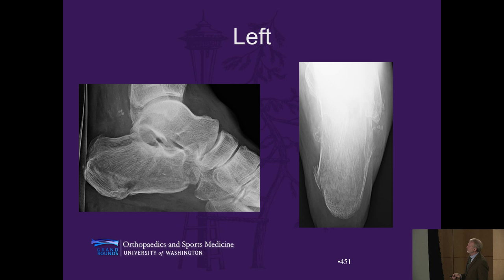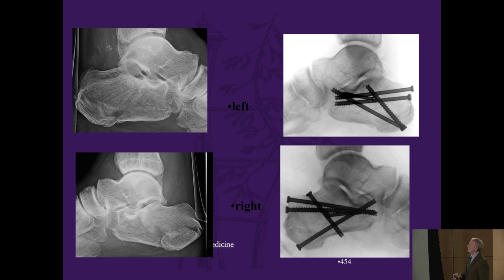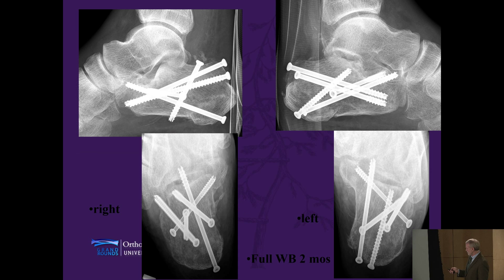And here's the left side that was even more comminuted. We followed the same pathway to reconstruction and restored the posterior and middle facet completely, nearly anatomic. The patient, of course, began walking before we told him to, but he managed to heal in this position, and this is him when I saw him back in clinic with no pain and virtually normal motion.